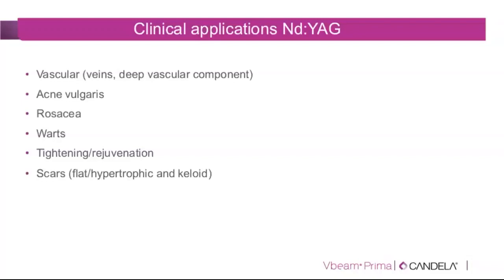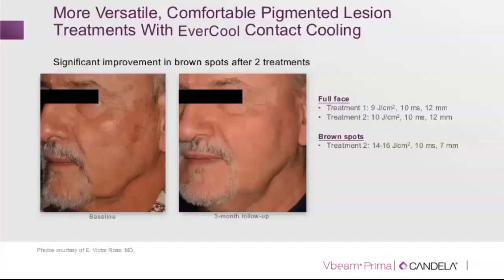But there are certainly other applications, such as acne vulgaris, diffuse redness or rosacea, warts, verrucas, tightening, rejuvenation, and scars, where studies have been published using the 1064 long pulse Nd:YAG or in the microsecond pulse.